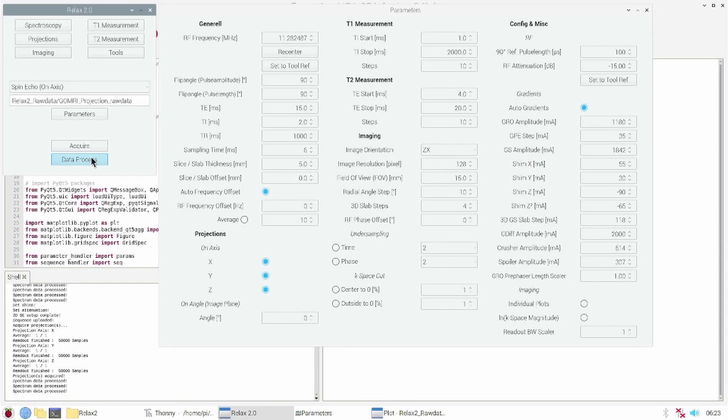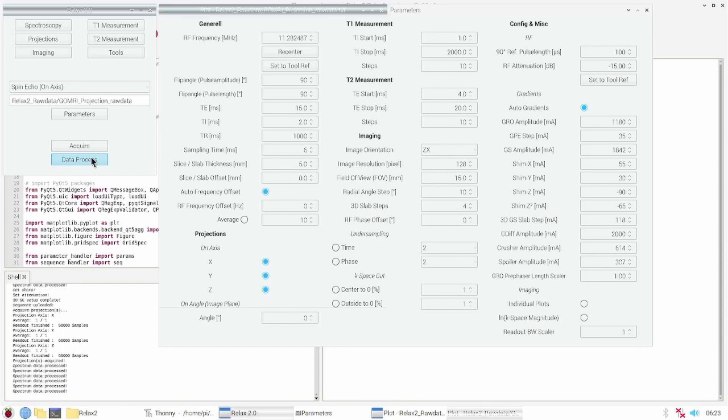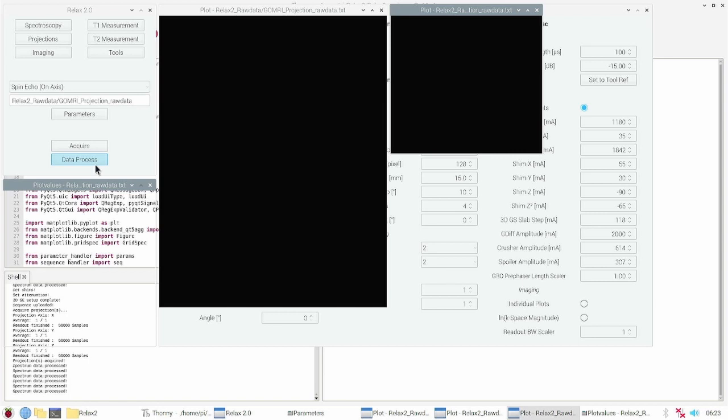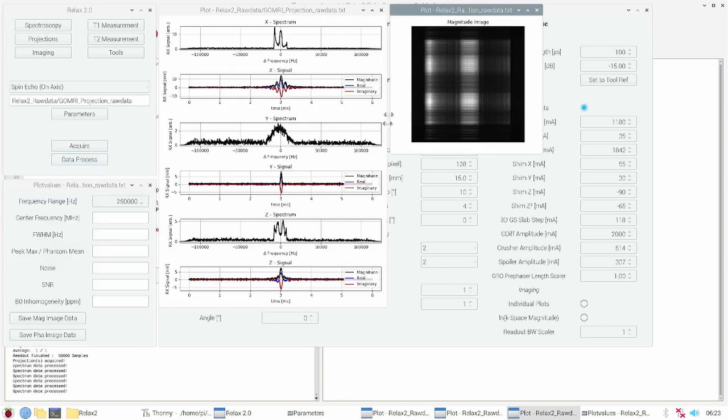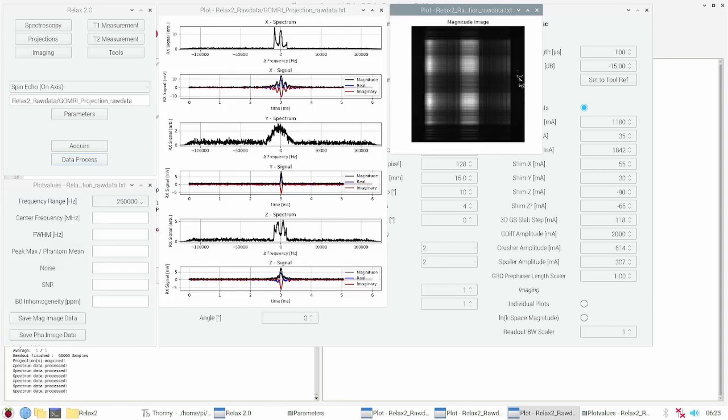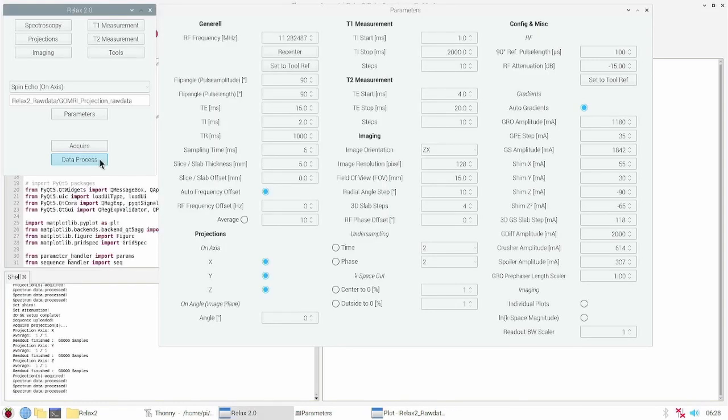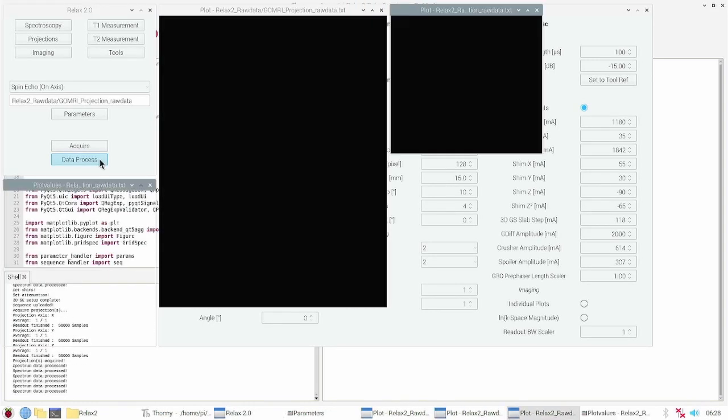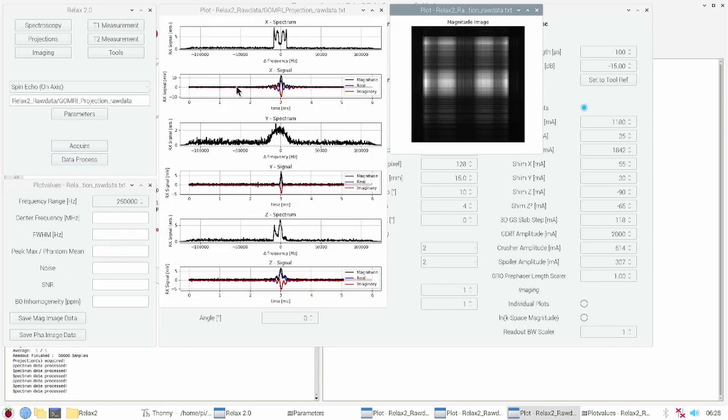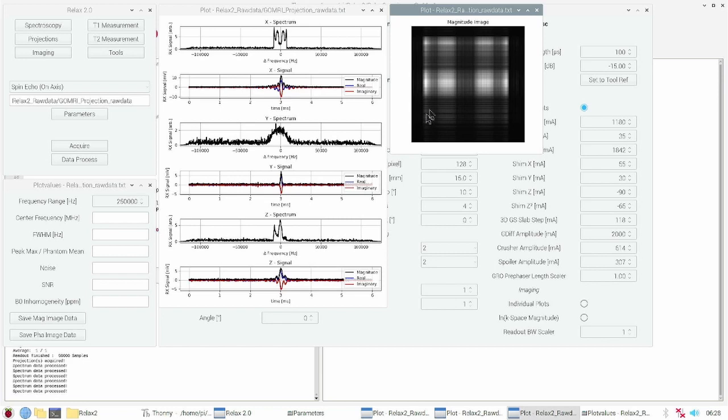I repeated the measurement with a two hole sample from the presentation. If I process the data you see the cross section of the chemical test tube in the image. I turned the chemical test tube by 90 degrees. Now the projections are inverted, what you also can see in the image.